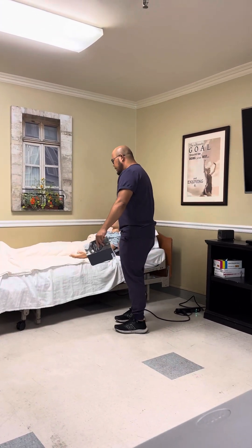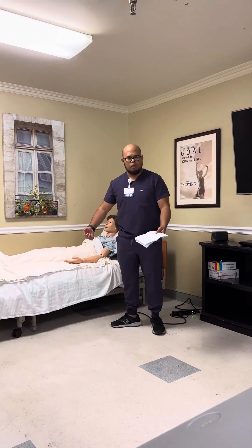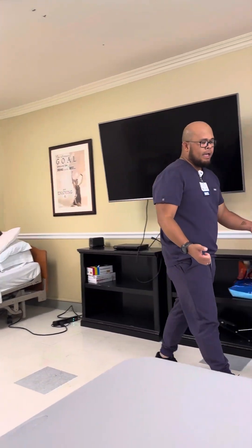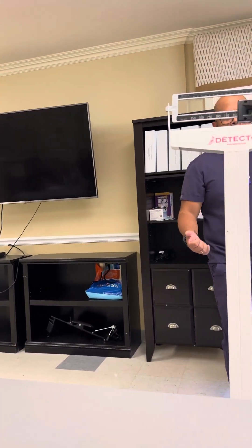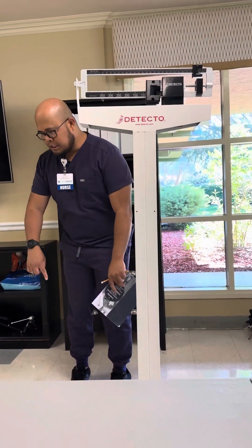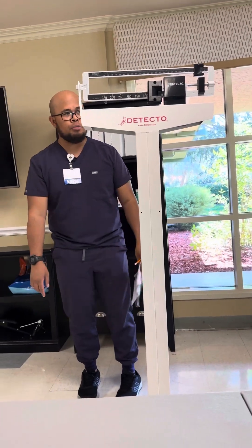The patient can walk, so you will tell the patient, come on, let's go for a walk. No need for the gait belt. You're just going to walk the patient over and then let the patient step on the scale.